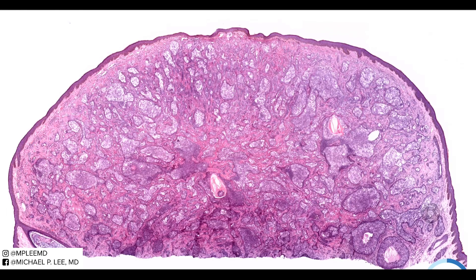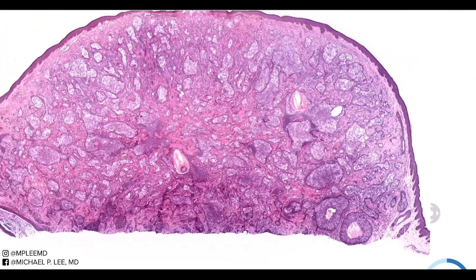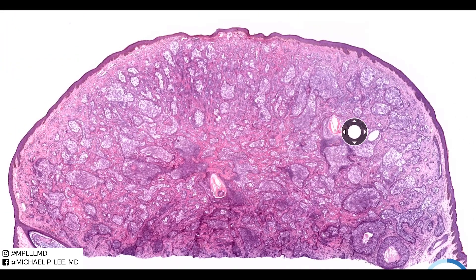Cutaneous lymphadenoma is an entity that has gone through quite a bit of criticism, mainly in the debate about the histiogenesis — what cell of origin these tumors are from. Originally they were thought to be a pilar sebaceous derivative due to the presence of some of these cells. They sort of look like sebocytes, and also sometimes you have connection to the follicular structures like you see here on our case.